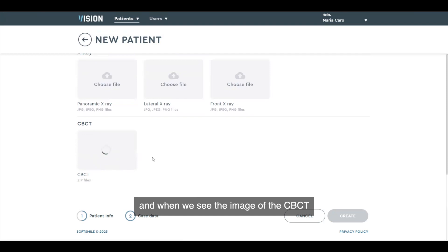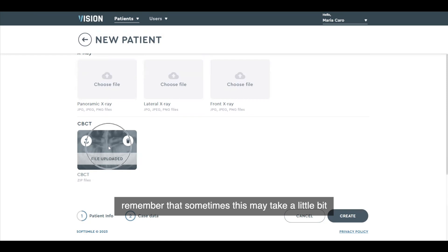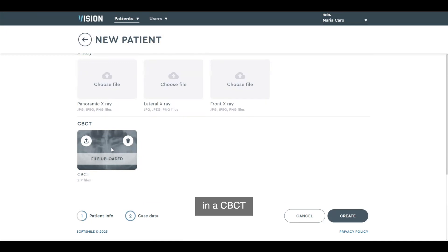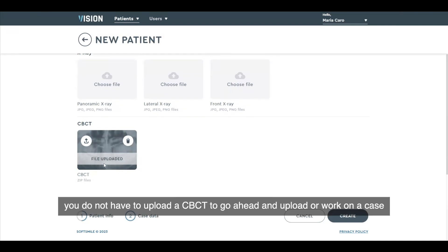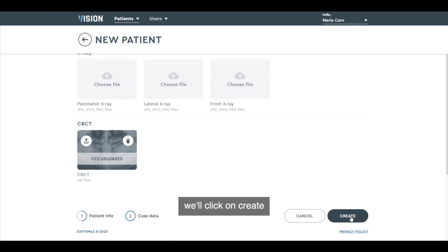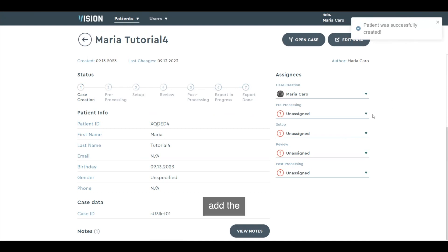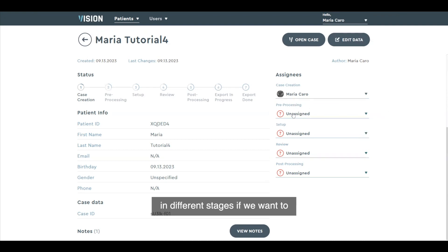While that is uploading, I'll double-check and make sure my STLs have been uploaded. When we see the image of the CBCT, that's when we know that all images and data have been uploaded. Remember, sometimes this may take a little bit — there are anywhere from 100 to 300 images in a CBCT. This is purely optional; you do not have to upload a CBCT to work on a case. We'll click on create. Patient was successfully created, and we can continue to add assignees that are going to be working on the case in different stages if we want to.